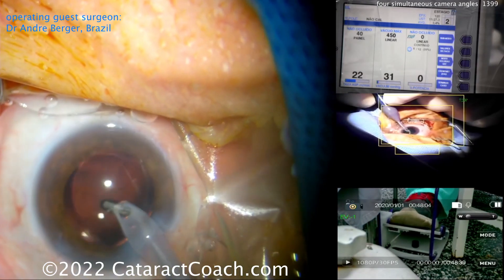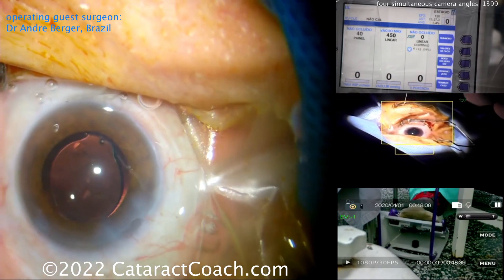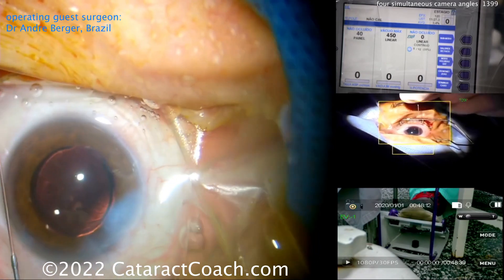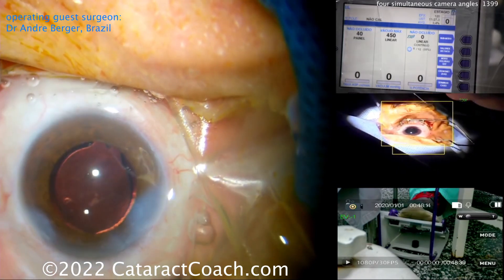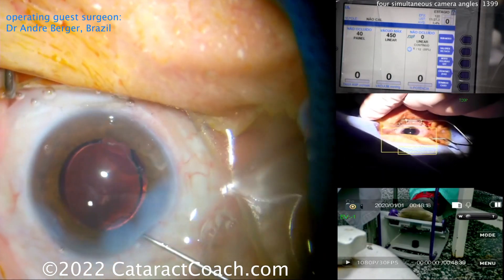Again watch his foot pedal in the bottom right corner — modulating the amount of vacuum gently and carefully at the end of the case. Sealing up the incision now. Look at the right side of the screen how he holds the hub of the cannula — very important so it doesn't shoot off into the eye. Nice sealing of the incisions, and that's a beautiful case.